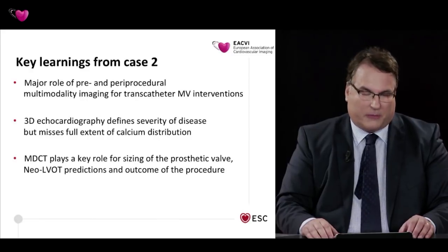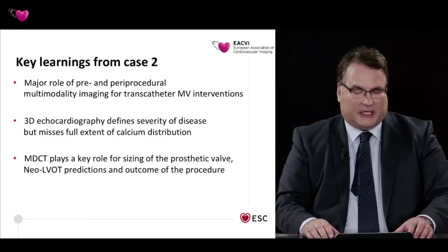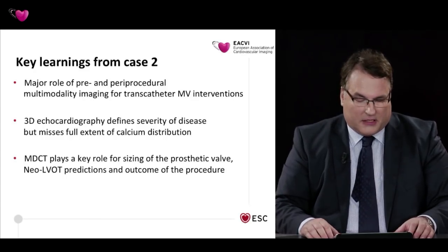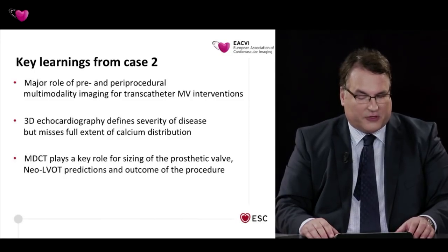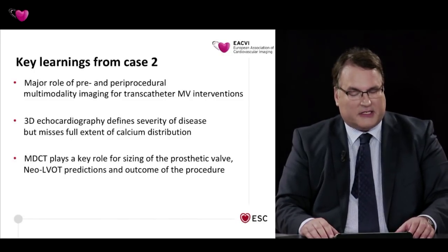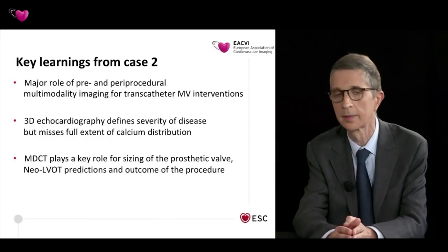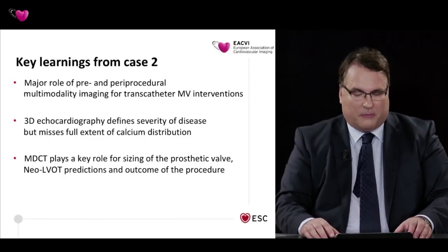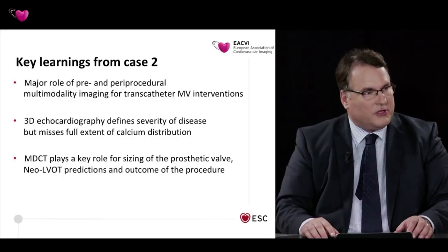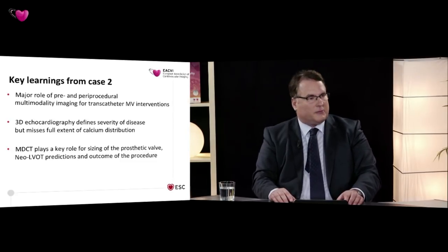There's another question coming up which refers a little bit more to your first and the second case. And the viewer via Gmail asked us, is 3D echo so essential for this procedure? Would you recommend it as a must-use item? I think he refers to the MitraClip procedure. And do you think, because the start of the e-valve implantations was firsthand a two-dimensional procedure, but 3D took more and more over. So would you say 3D echo is a must-have for a MitraClip procedure?